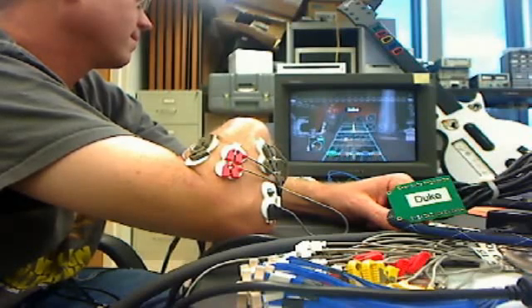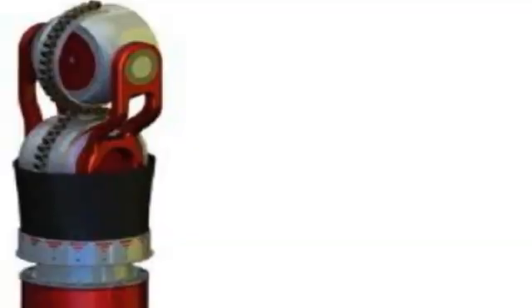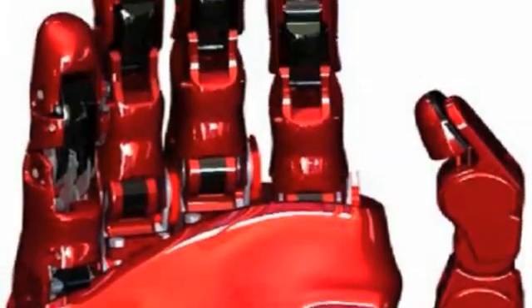Air Guitar Hero is the latest development in the ongoing DARPA project to create the next generation of prosthetic arms. The project's final limb, including the arm and hand, will have 22 degrees of freedom.